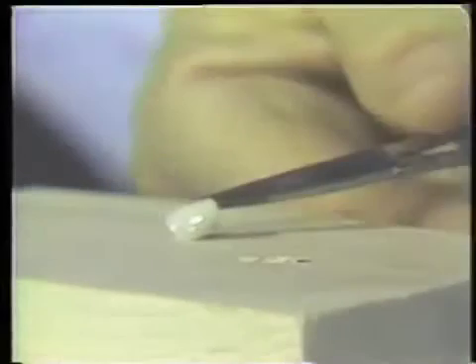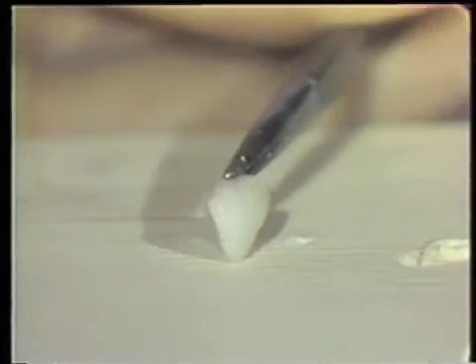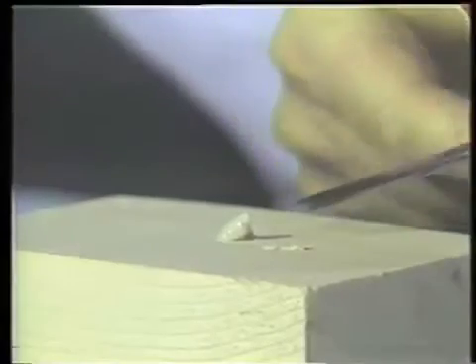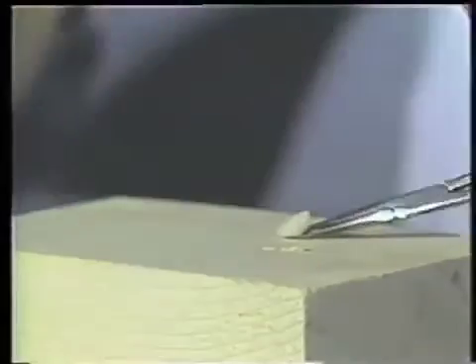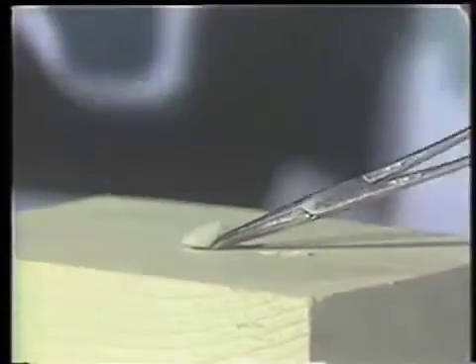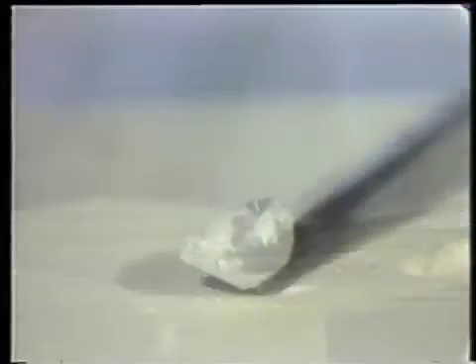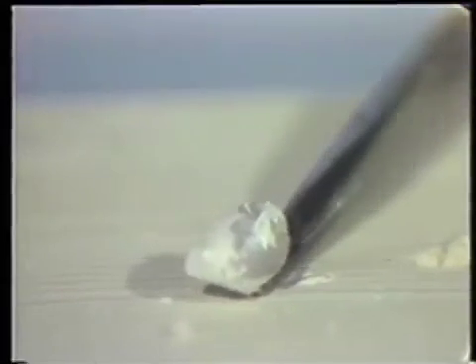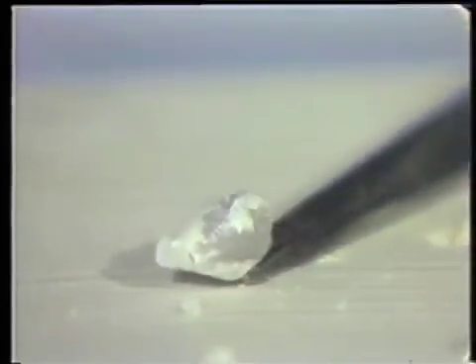Starting to get some cracks. Now, if you notice there are some cracks developed in this. I'm going to change the location of the hemostat and tap it from the front, and see if we can get this to crack. There, we finally got it to crack. Now you can see the tremendous amount of force that it has taken to get this to pop.